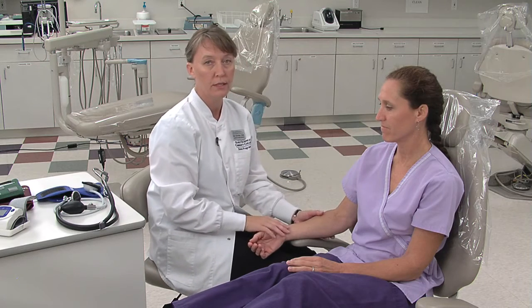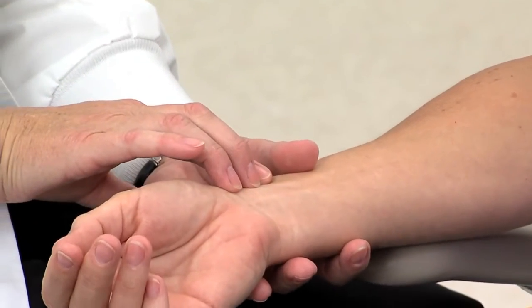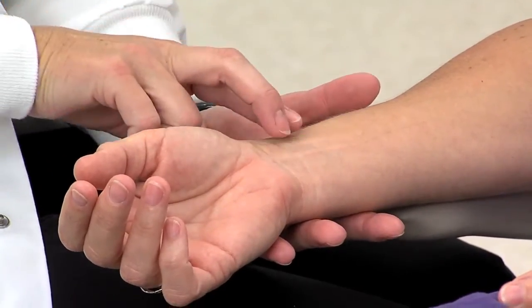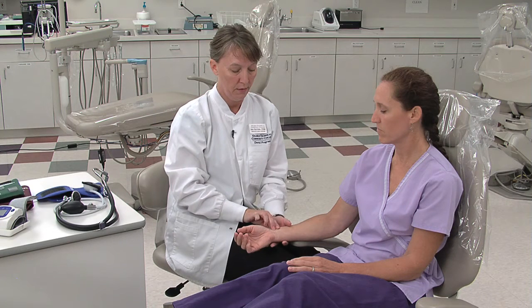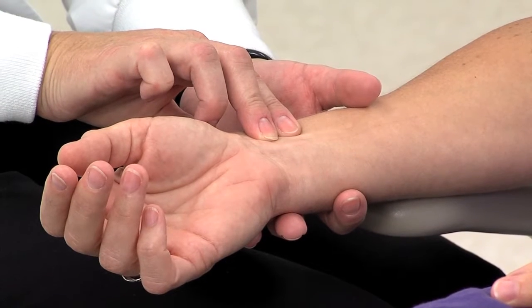The first vital that you want to take for your patient is the pulse. You need to determine the pulse rate in order to know how far you need to pump up your sphygmomanometer. Have the patient just gently rest their arm on the chair, and it's best to have a second hand either on your watch or someplace in the room that you can watch. What we want to do is hold our fingers on the pulse for at least 30 seconds. It's important to do a 30-second pulse so that you can catch any irregularities in the pulse rate.